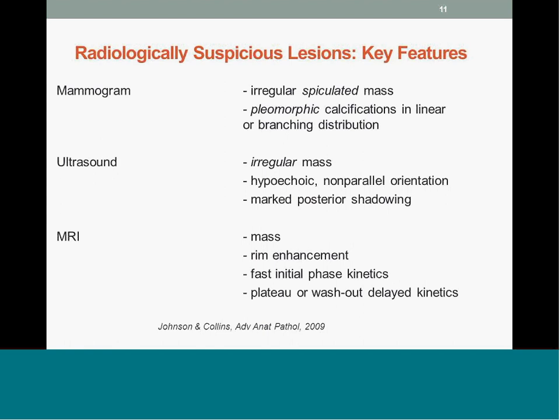Spiculated is one of them. When I see spiculated, I'm looking for invasive carcinoma. It's like the cancer of the crab, those tentacles going in every direction. So spiculated is either invasive carcinoma or possibly a radial scar. And if I don't see invasive carcinoma when they say spiculated, that's discordant.